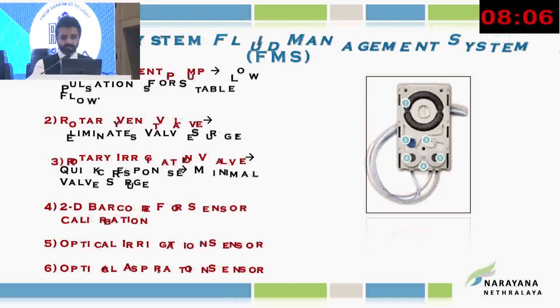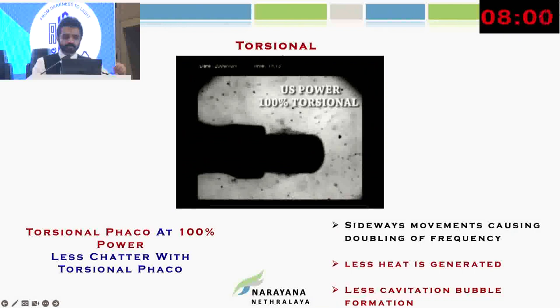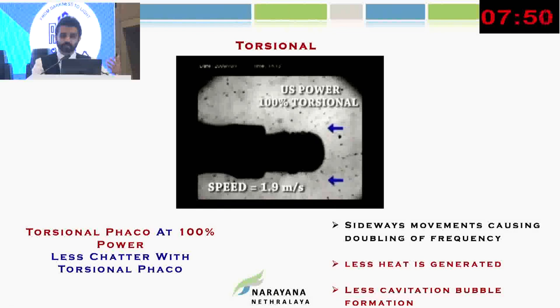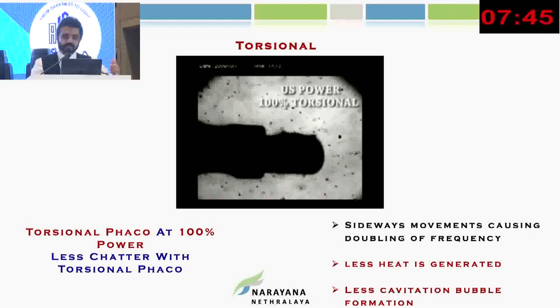Now, when you look at the torsional technology, if you see the pieces, I don't know if you can see my cursor. Oh, yeah, it's visible, right. If you see the front part of the phaco tip, you can see the pieces coming towards the tip, which is very important for followability. And also because of this technology, the amount of heat generated is lesser, and also there are lesser cavitation bubbles, so that it creates a very nice environment for you to do your phaco surgery in peace.